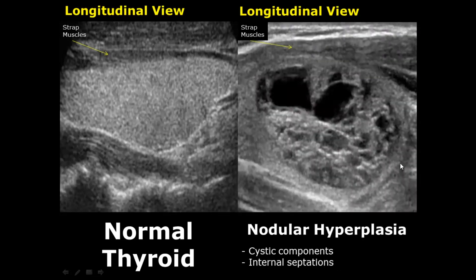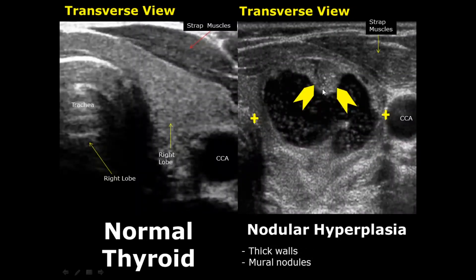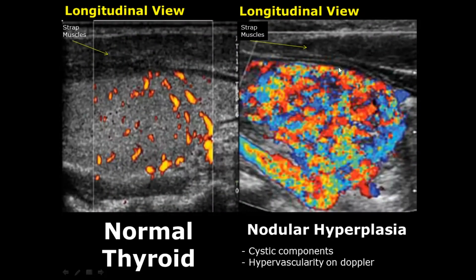Nodular hyperplasia can have many appearances. This image shows internal cystic components and multiple septations. Here is another case of nodular hyperplasia having internal cystic components and a spongy appearance. They can also have thick walls or masses attached to the wall of the nodule — these are called mural nodules. Here is an image showing hypervascularity on color Doppler, which is another feature of nodular hyperplasia.